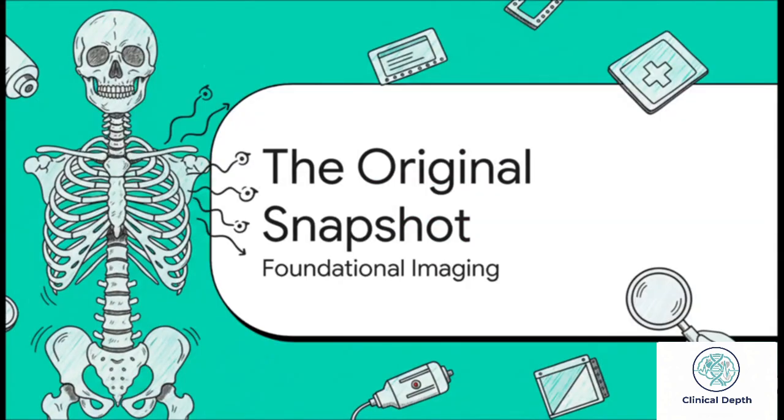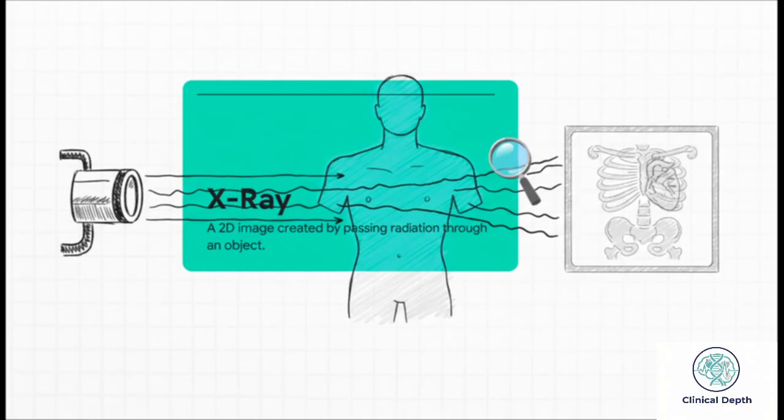So, first up, let's talk about the original, the X-ray. For more than a century, this has been the go-to, the foundational tool. It was our first real way to peek under the skin without making a single cut. Pretty incredible when you think about it. At its heart, an X-ray is beautifully simple. A machine passes a little bit of radiation through your body, and that creates a two-dimensional image on the other side. Just think of it like a snapshot, a single, flat picture.